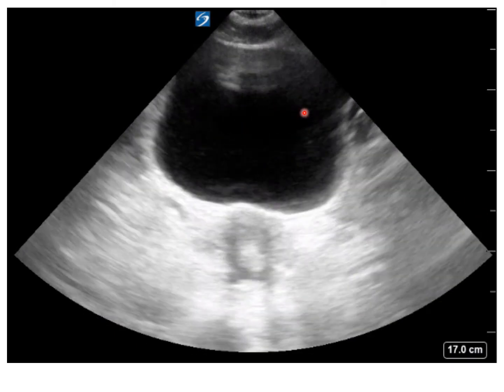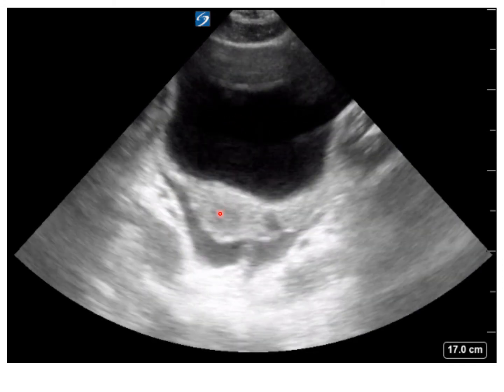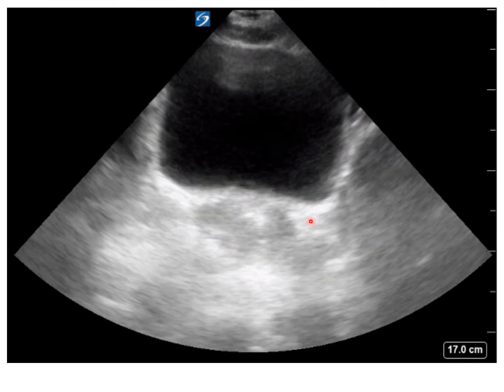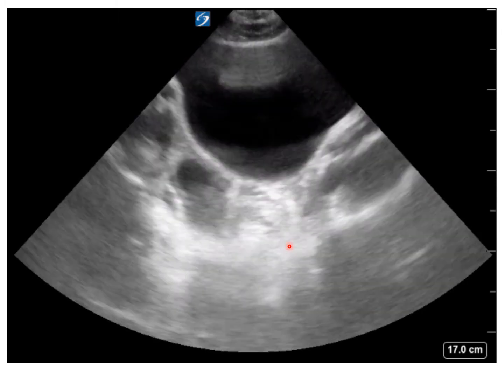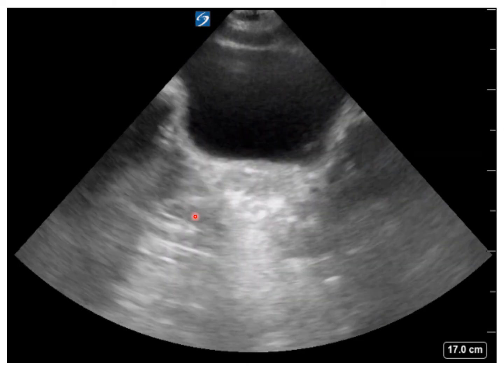Here's what that would look like with free fluid. So large bladder, behind it, tiny uterus floating in some free fluid. So here you can see that this free fluid is behind the uterus, so that would be in the pouch of Douglas.